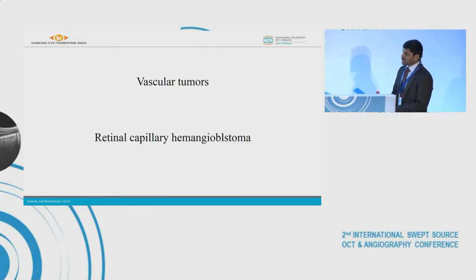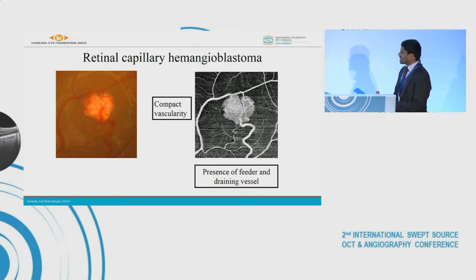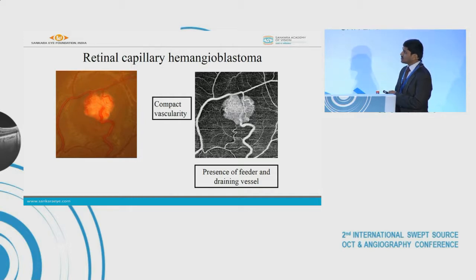Coming to the vascular tumors — the retinal capillary hemangioblastoma. This is a case of large retinal capillary hemangioblastoma in a known patient of VHL. We can see that the tumor is characterized by the presence of a compact vascular signal with hardly any intervening spaces.